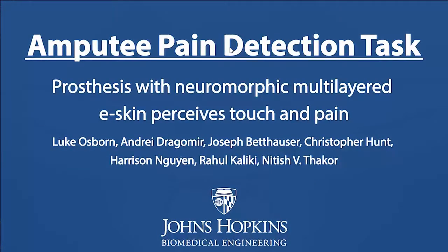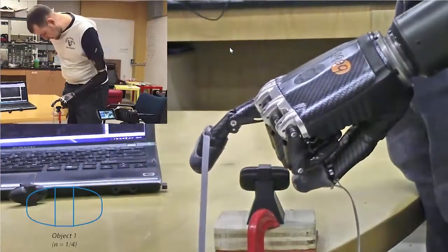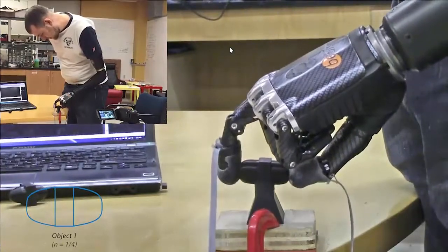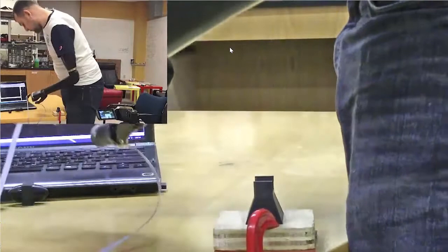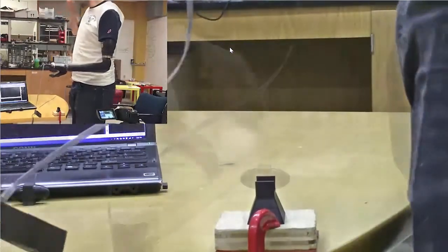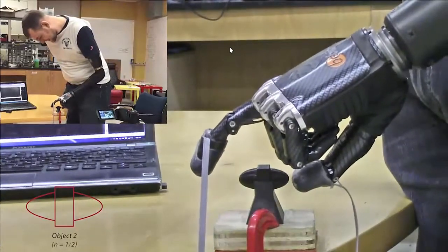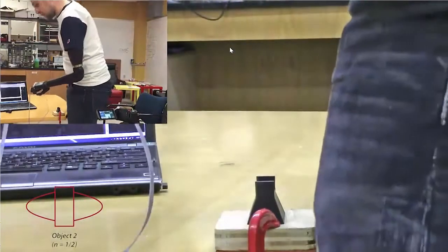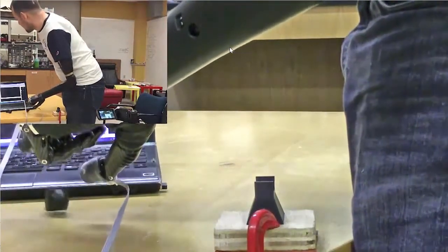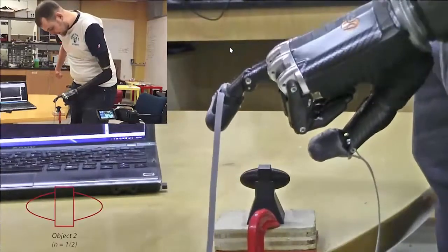Okay, so let's now take it to the MPT. In this case, you saw the young man who, in the very first video I showed, is now controlling the prosthetic hand. And, through that control system I showed you, he was controlling the hand, or actually individual fingers. He is able to pick up these delicate objects. So it's pretty good precision control of his prosthetic hand. And so far, so good.